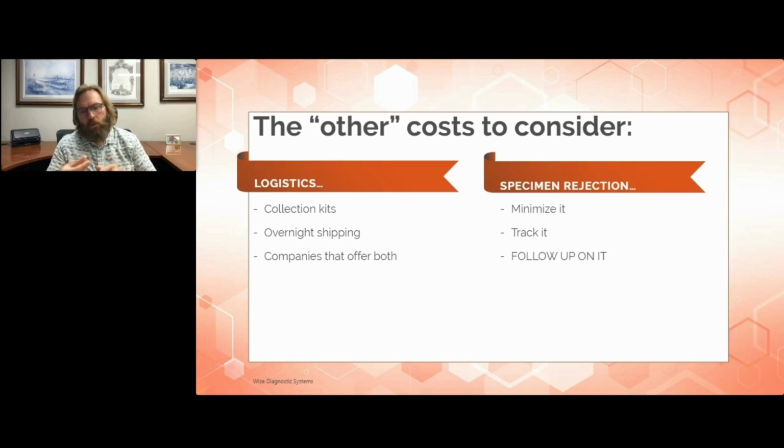So folks had to bend it over to get it in there, or they said, well, it must not go in here because it doesn't fit. We were able to talk to the clinical side folks and say, I know it changes some things when your tube is a little bit longer, but can we up the size so that the break point allows the swab just to drop and stay in? That allowed us to improve it on our side of things.